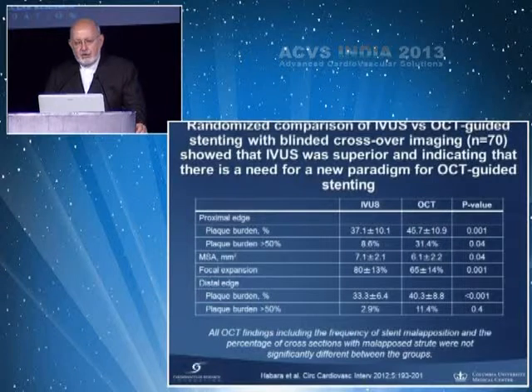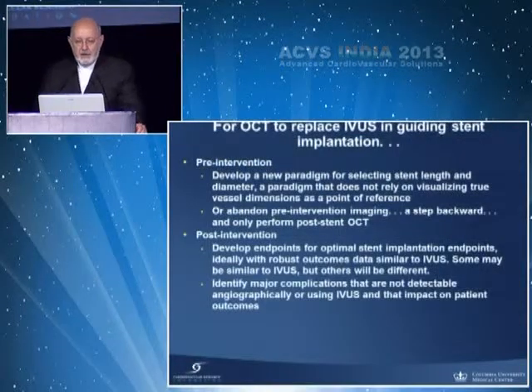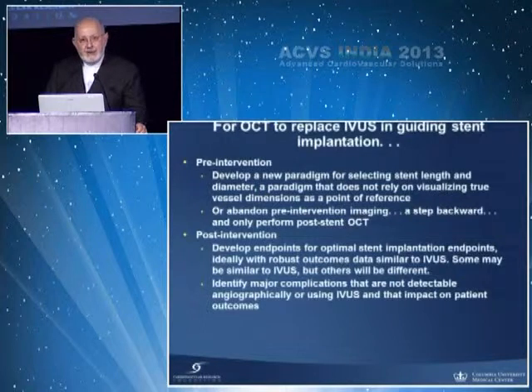And in a very small Japanese study comparing OCT and IVUS guidance, you saw an improvement in stent expansion and less edge plaque burden in the IVUS guided group compared to the OCT guided group. While I say that I believe OCT has a bright future, the future is not yet here.